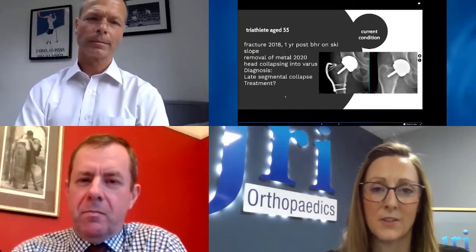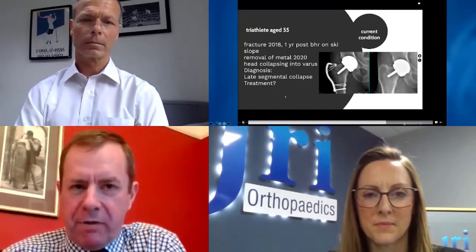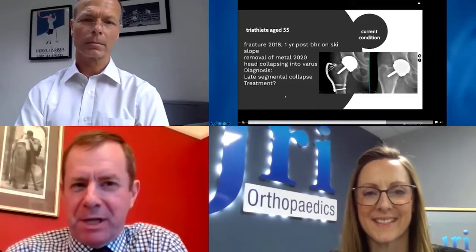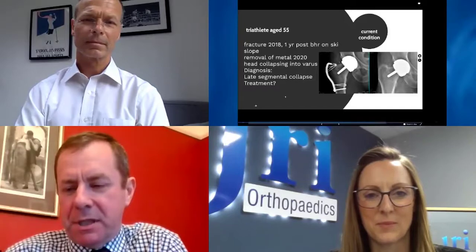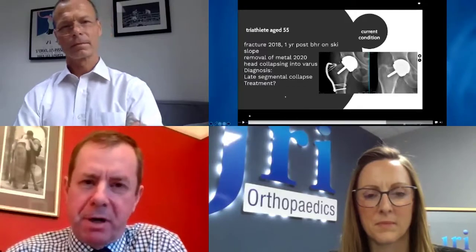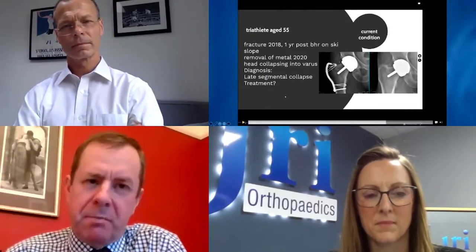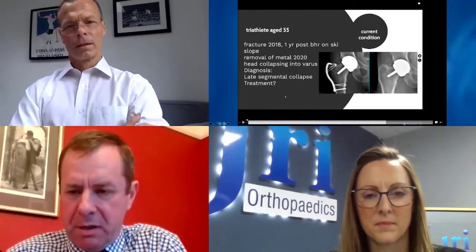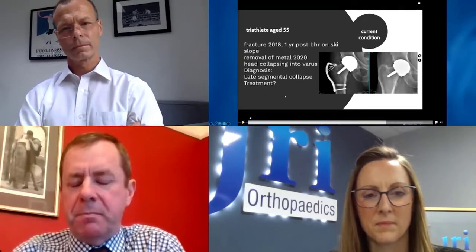Okay. And have you experienced the same, Kerry, revising the resurfacing? I have several triathletes running around with Evolution, so I would have done that in the first place and avoided that problem. But yes, I agree with you, Johan. Evolution is a pretty good revision stem. Resurfacing revision is not demanding of the femoral side, so I would revise it with an Evolution. I've got some cases in my collection to show in a little while of slightly more adventurous Evolution revisions.